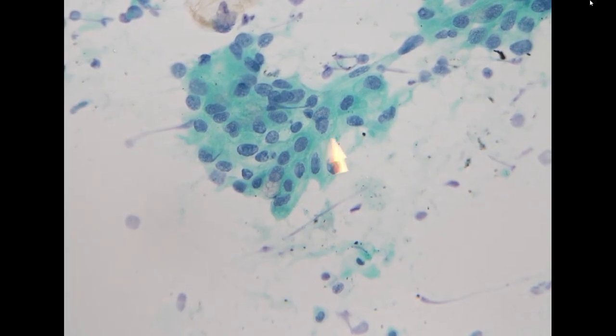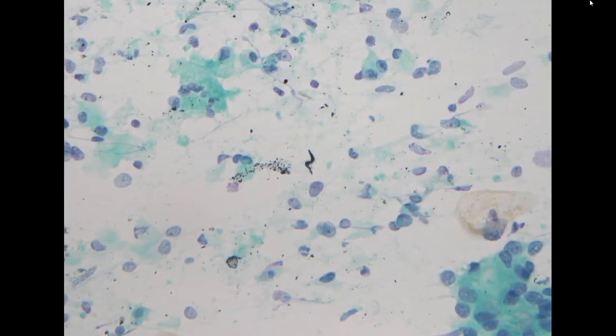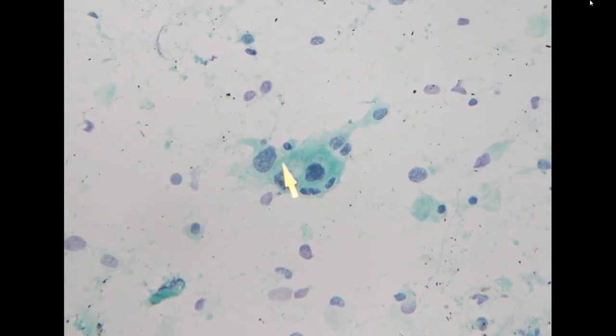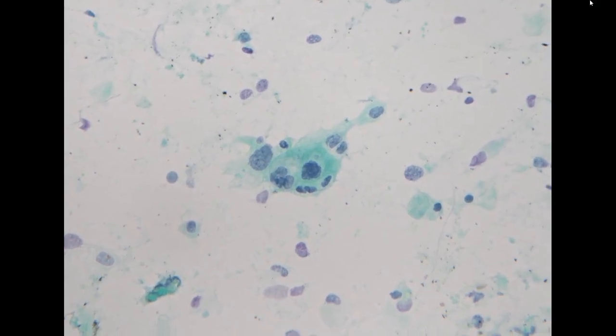So this is adenocarcinoma. This is not normal. So these are all adenocarcinoma. We didn't see very prominent mitosis, but here you can definitely appreciate this is atypical, and this is a mitosis over here. So this is positive for adenocarcinoma.